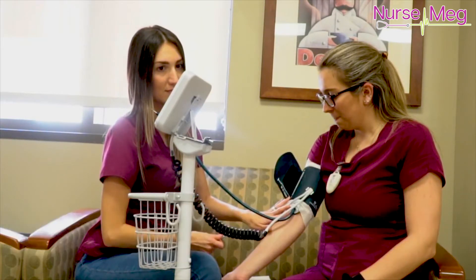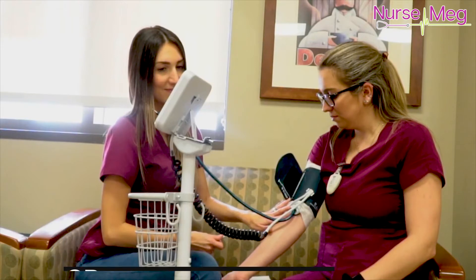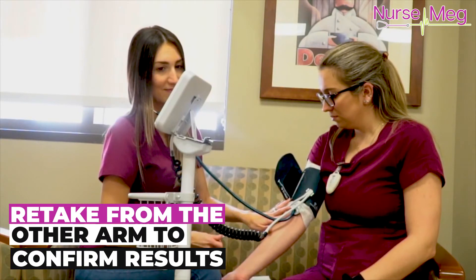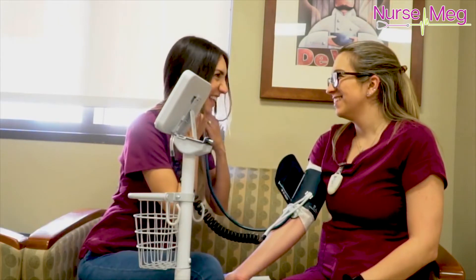If the patient's blood pressure is super elevated, above 150 over 100, it definitely requires some attention or some medication. If the blood pressure is extremely low or extremely high, or the patient was moving too much, be sure to take it again on the opposite side just to confirm your results.